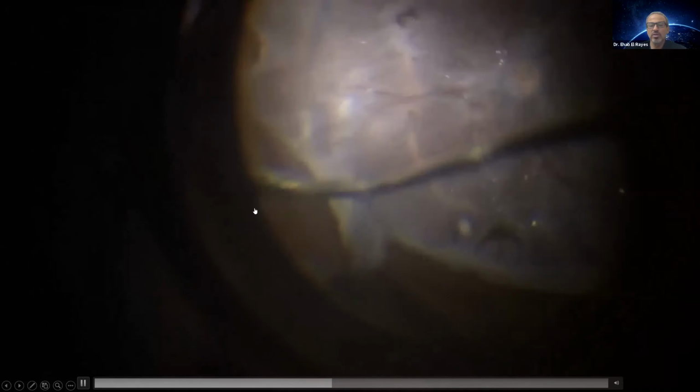You do release it from the retinal periphery, but you try to keep as much retina as possible. Sometimes the retina looks worse than what you can achieve. If you give some time bimanually, like here I use the scraper for cleaning the retinal surface while supporting the retina, you can easily have more retinal surface, sparing retina inside the eye, opening it like this before putting your perfluorocarbon to support it, then clean the retinal edges. I don't just cut these edges of the break, but I spend time cleaning them or rolling them hand by hand, removing as much as possible of the membranes.